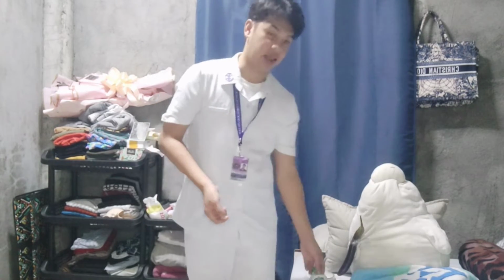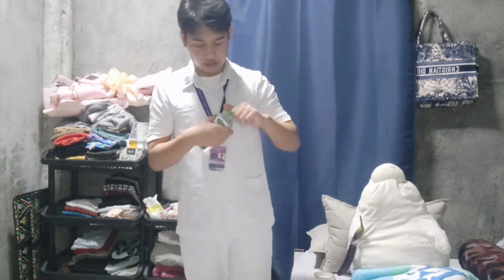Next is perform hand hygiene and observe other appropriate infection prevention procedures. This is to deter the spread of microorganisms. So I have here the antiseptic alcohol.